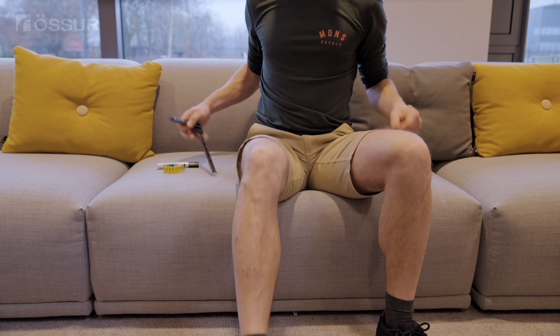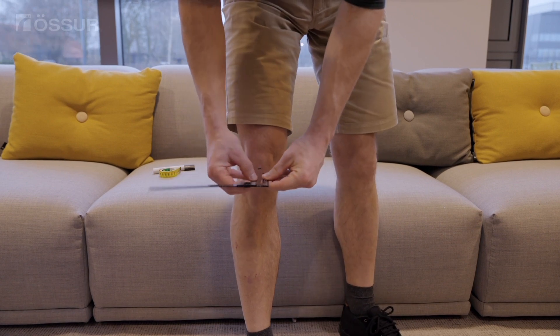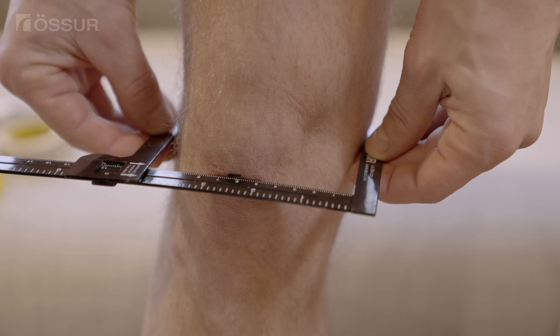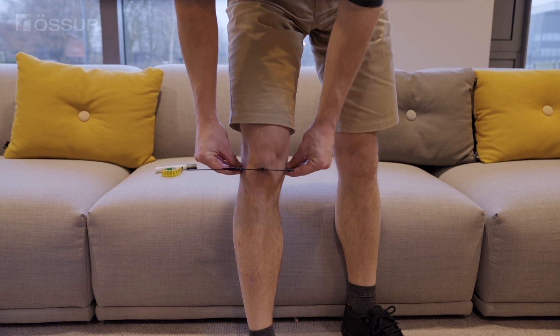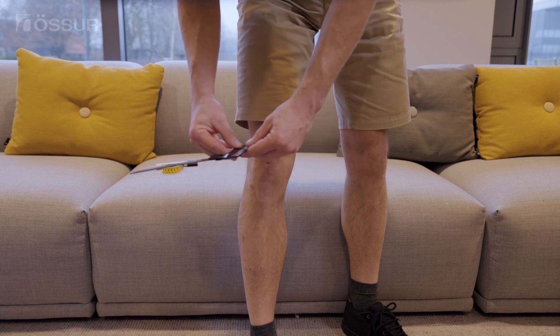Caliper Method to Determine Knee Width: Take a caliper tool and measure across the middle of the kneecap to determine the correct width of your knee. Make sure the caliper aligns with the center mark and the edges of the caliper touch the widest part of your leg, not just the width of your kneecap. Take the measurement in a weight-bearing position without your knee locked out.